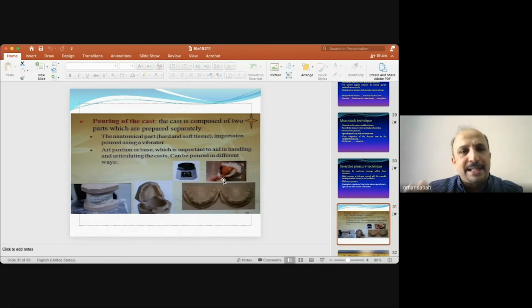Then I increase the thickness of the stone, adding it onto these very thin layers on the tray, and I am sure that all the touching surfaces available on the special tray are now covered with the stone. I am no longer afraid of the bubbles because I checked from the first steps, without needing to return back to them.